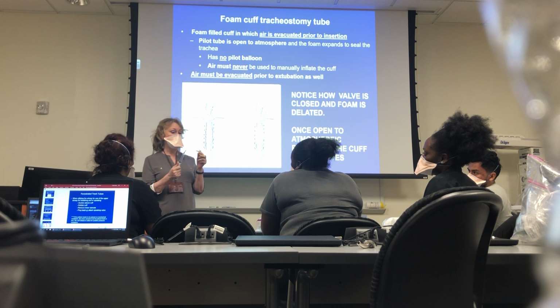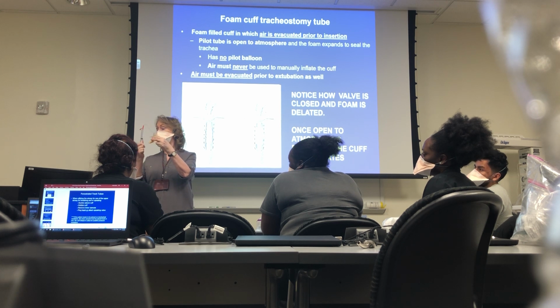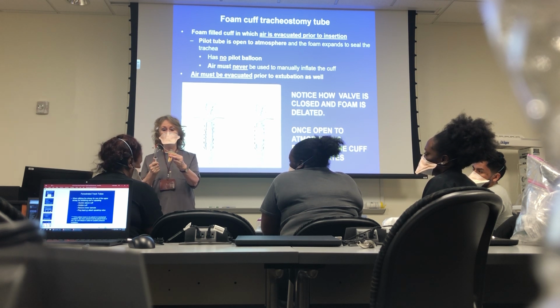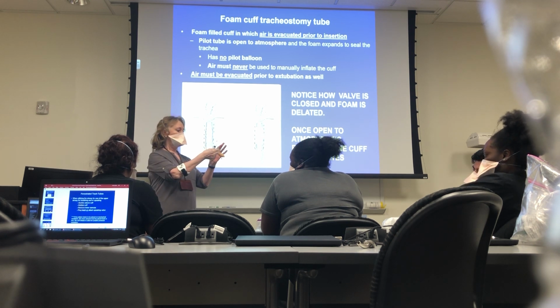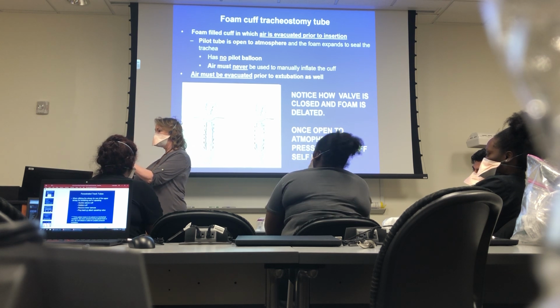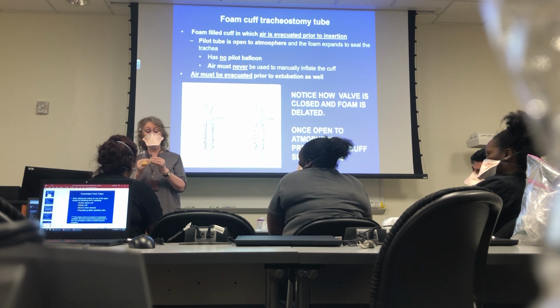All right? So, the way these work is that when I'm inserting it, I have to take the air out of this sponge. So I put it in the patient, the physician puts it in, and then he undoes this, and this must be left open to the atmosphere, because this cuff does not take air. It just inflates with atmospheric pressure until it seals the trachea. So, it must be left open.